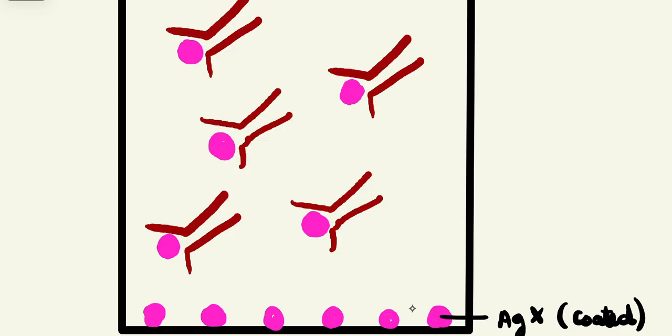As a result, the antigens which we have coated inside the well will not bind to any such antibody. After this, we introduce the secondary antibody. Now a secondary antibody is the one which will contain the enzyme. So here let's say we have added this as a secondary antibody and it contained an enzyme. So this is my enzyme and this is my secondary antibody.